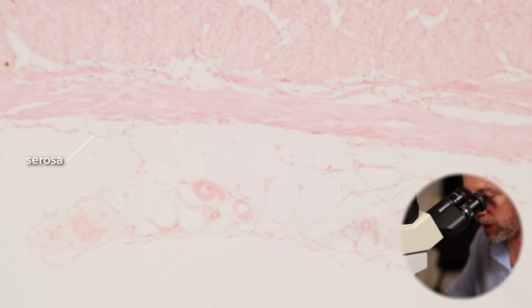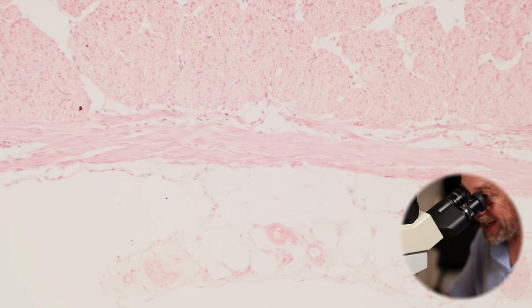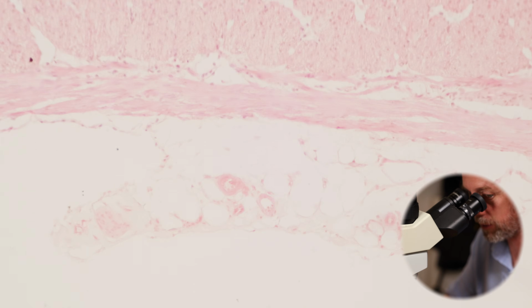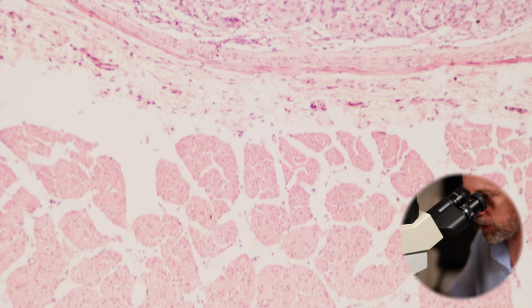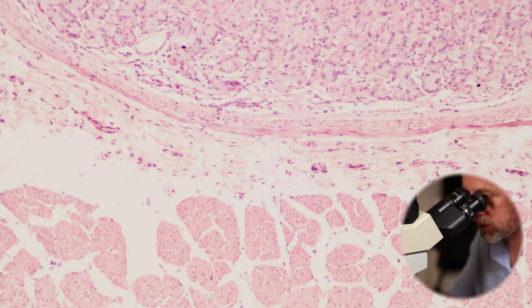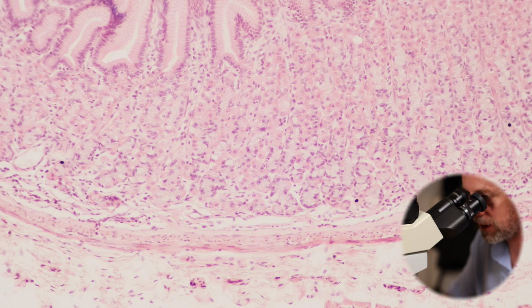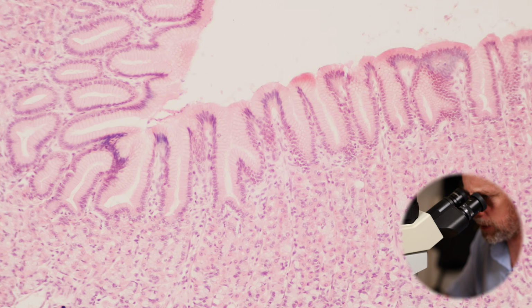There we go. Look, there's a bit of very lightly staining, but we've got some, looks like some fat cells and some blood vessels and what have you in there. And that's it. That's the anatomy or the histology, the cellular arrangement of the stomach. Look, if we go from the outside, we've got a layer of muscle, submucosa, thin layer of muscle, gastric glands up against the lamina propria, and the gastric pits.